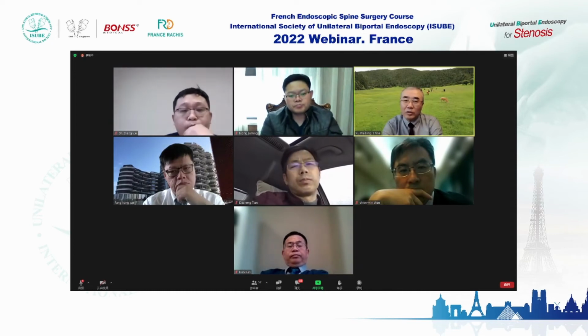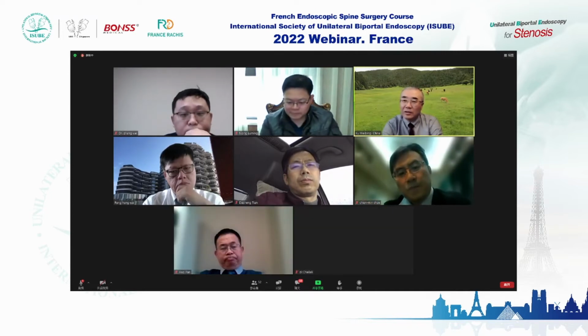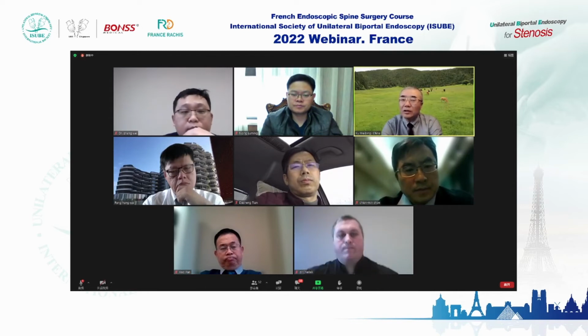If we do surgical PCF, we can use microscope, also we can use uniportal endoscopy or biportal endoscopy, 3 methods. What's the difference, including advantage and disadvantage for the 3 methods? Microscope, uniportal, biportal. What's the difference for PCF?